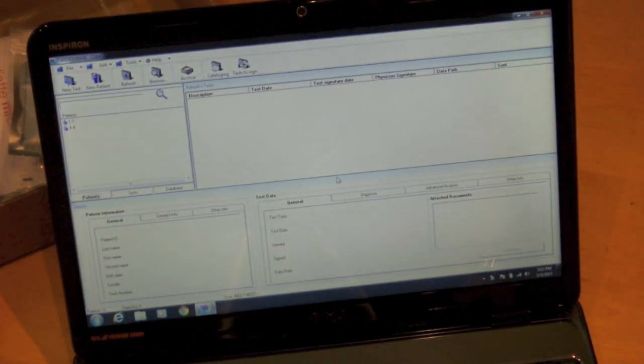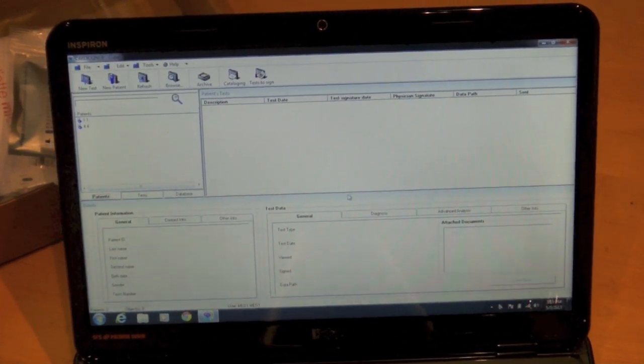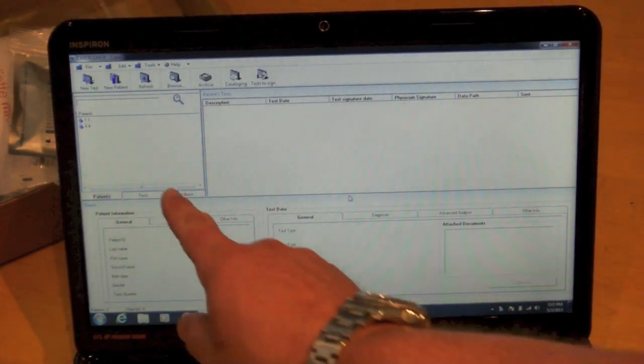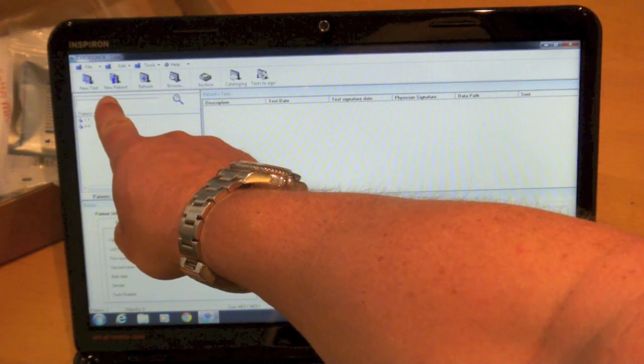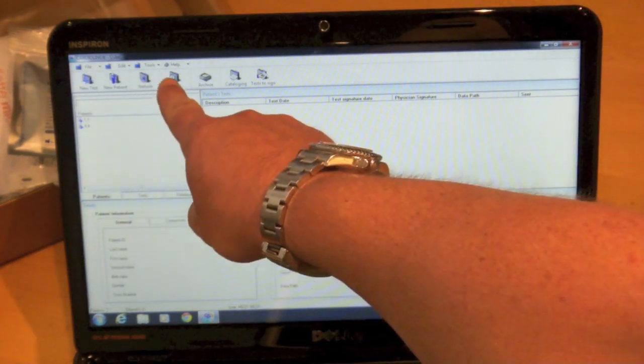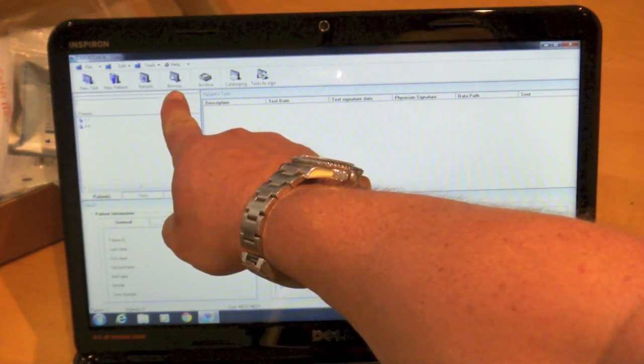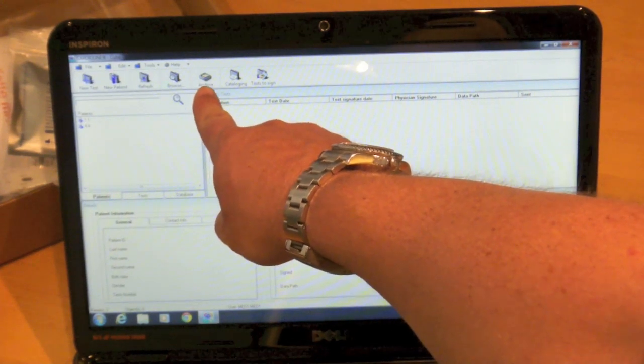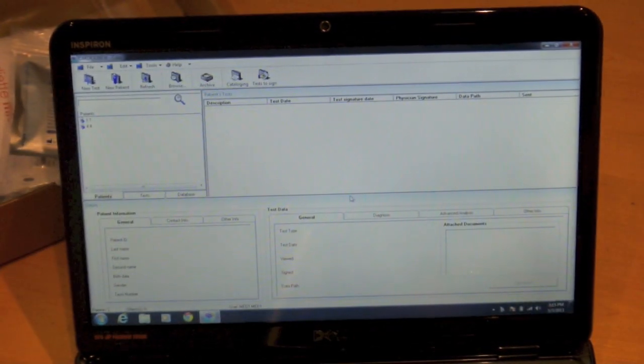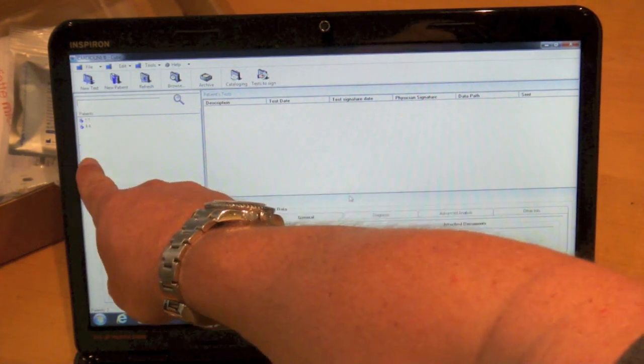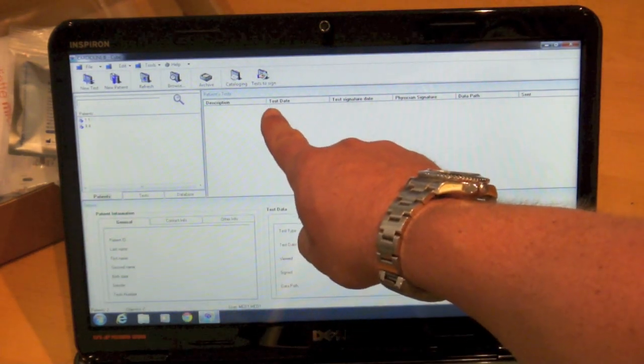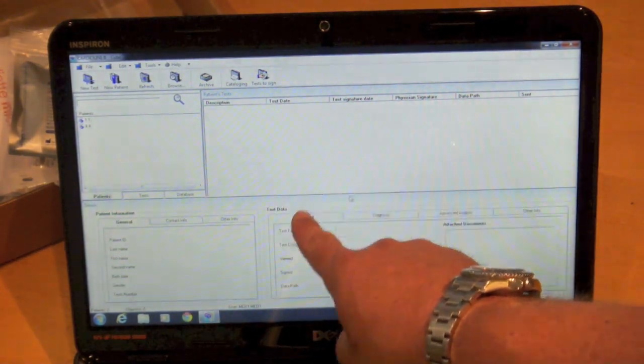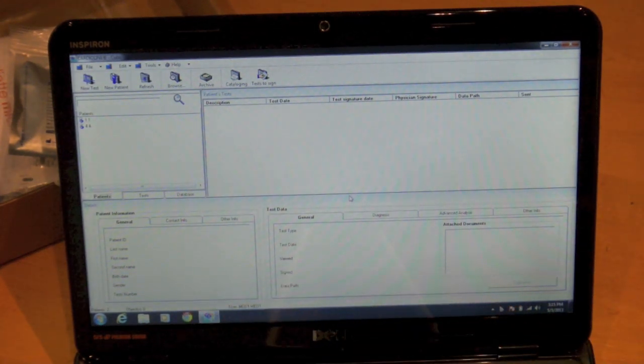So here is the standard interface for the Cube software suite. Up here on the left you see new test, new patient, refresh, browse to browse the patient database, archive to put it to a disk or elsewhere. And you see the patient name list as well as the patient tests for patients of that name, details on the patient and test data.